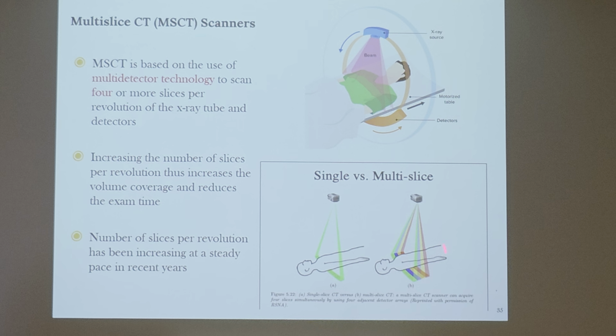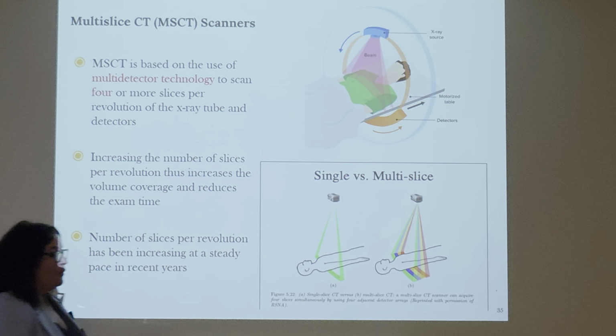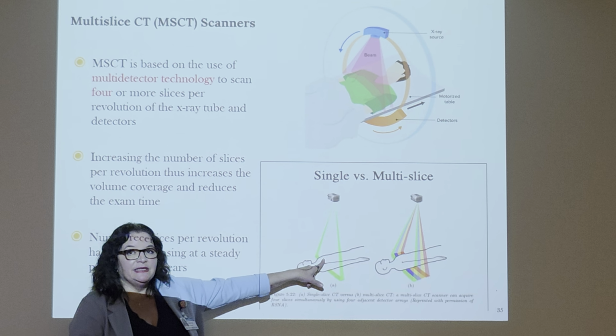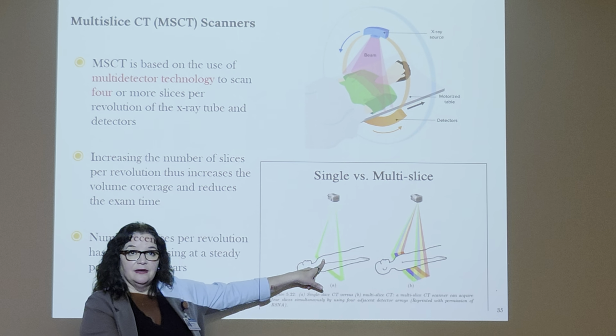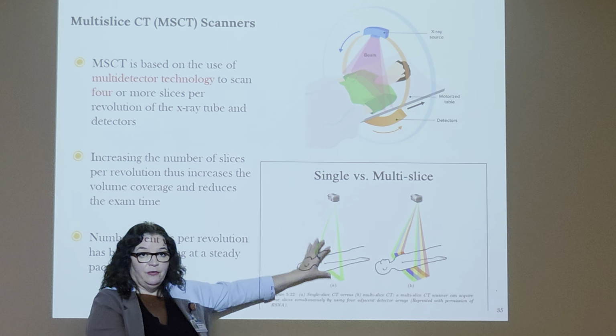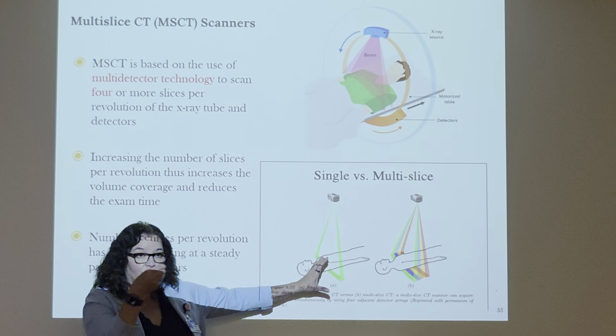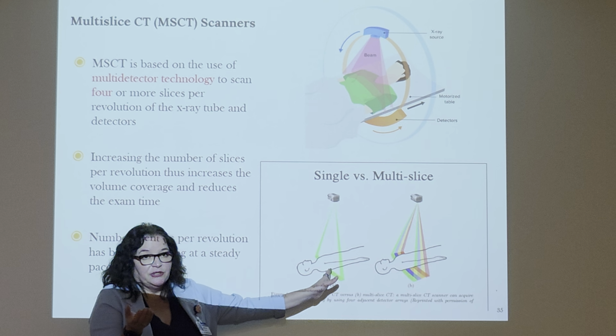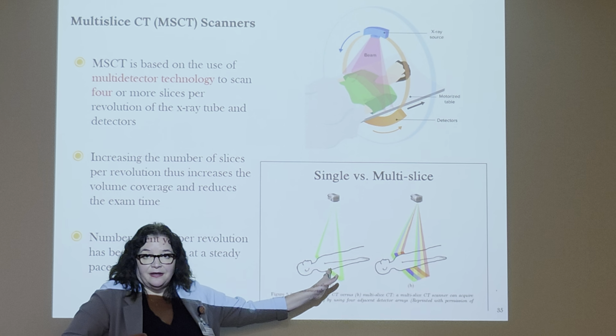It's adding a slice, so it's adding thicker. To where though? To the side? It's adding more, kind of like a cake, adding more slices to it. Right. Before, when we were here, it was capturing this data on one scan. Layers. All of this data right here, the thickness, the width, remember? Because you can only capture data of where you're scanning, right?